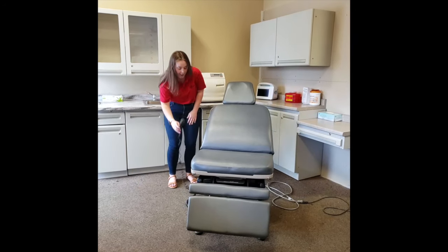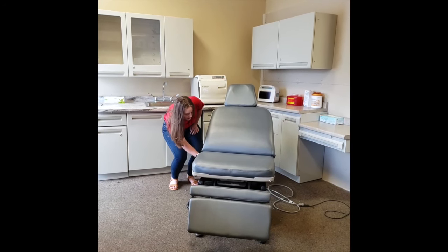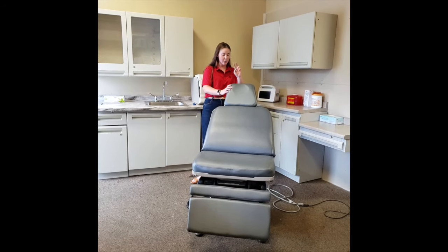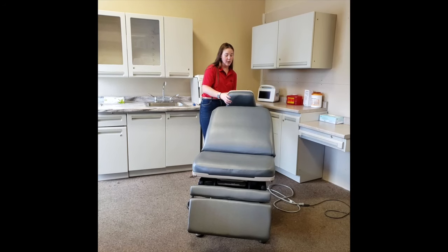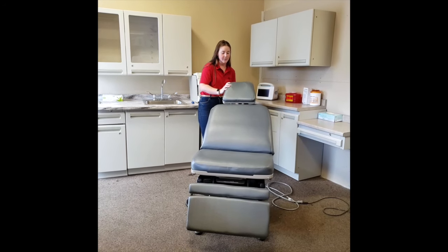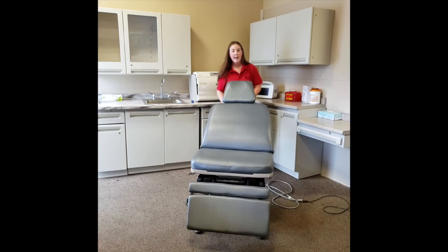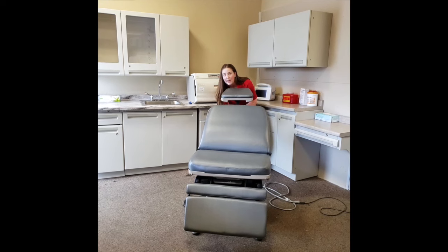These are all the automatic features on the chair, but there are a few manual ones as well. In the back, we can adjust our headrest. There are two levers — the first one you pull backwards, adjust the headrest, and then push it forward to lock it. The second lever will address the base of the headrest.